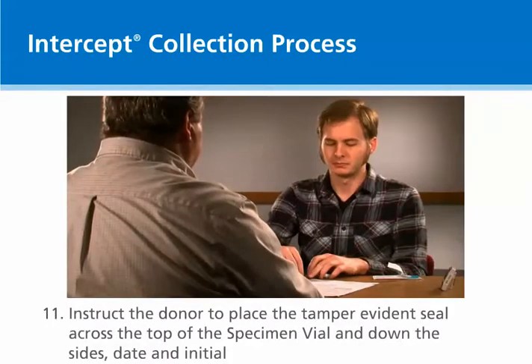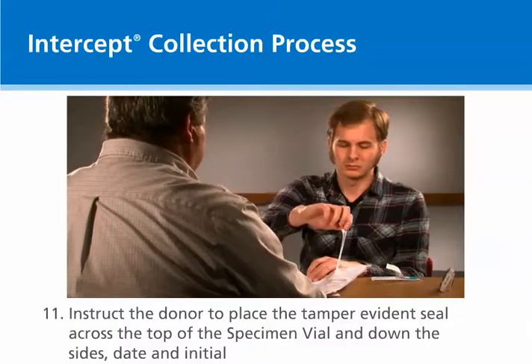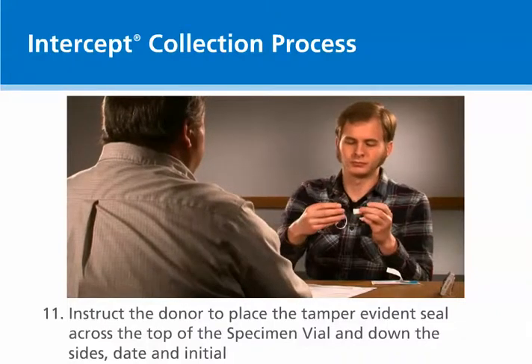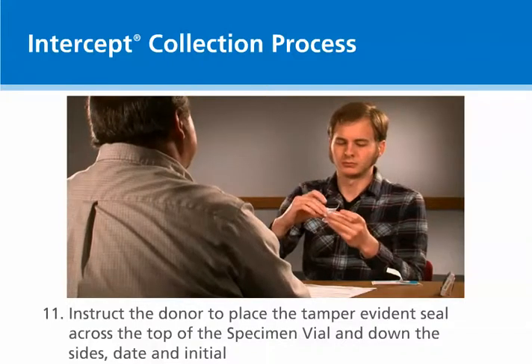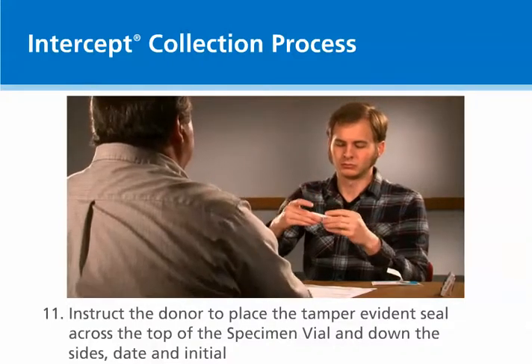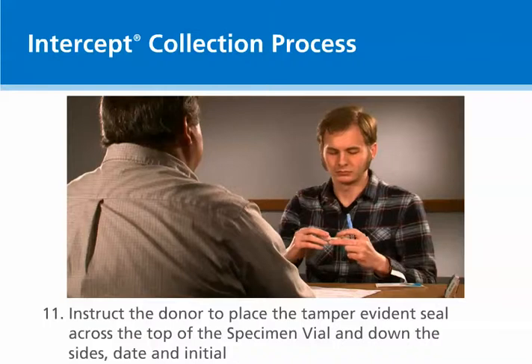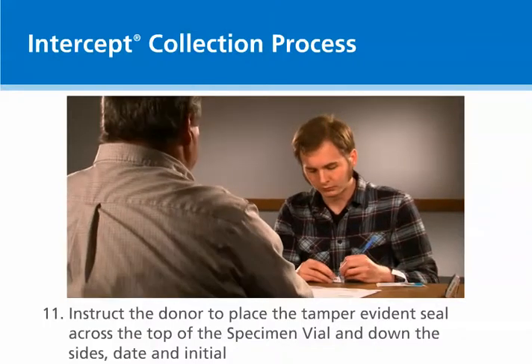Peel back a tamper-evident seal from the COC form. Instruct the donor to place it across the top of the specimen vial and down the sides. The donor will then date and initial in the spaces provided on the seal. In some drug testing policies, it is recommended that the collector dates the sample seal to eliminate any attempt by the donor to compromise the sample by putting the wrong date in.